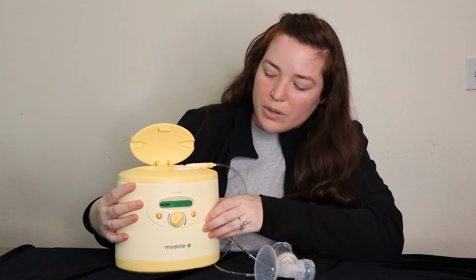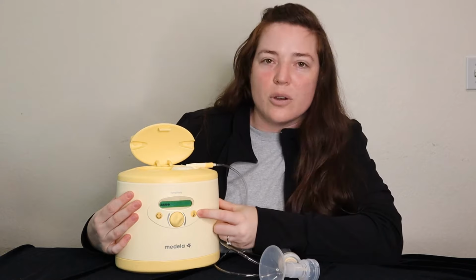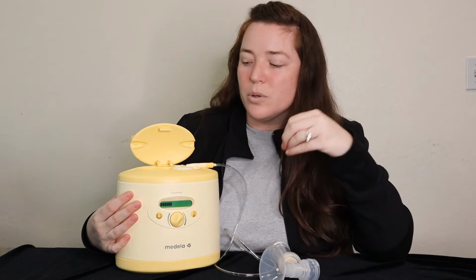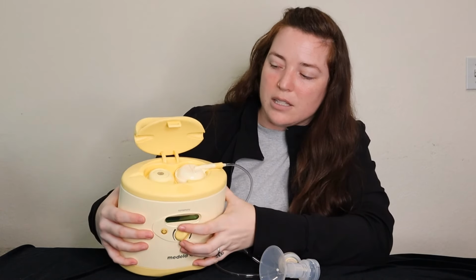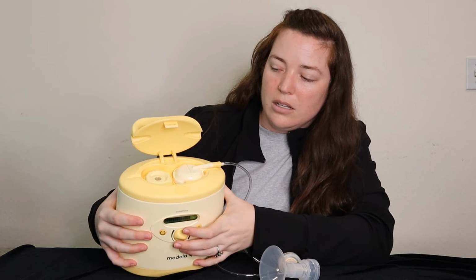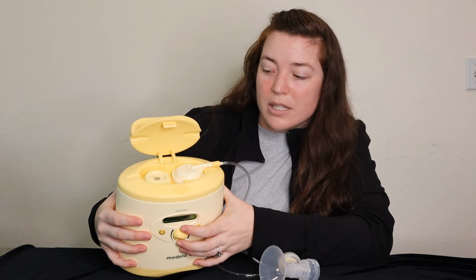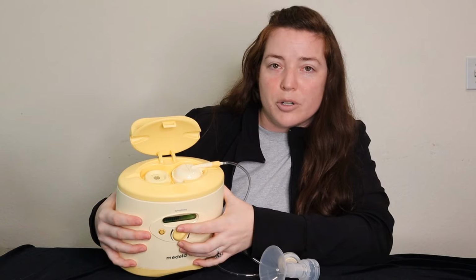Once your milk starts flowing, you're gonna wanna hit this button with the arrow and the drops, and that puts it into expression mode, which is those longer, deeper pulls to really get the milk out. So you can see it's moving a lot slower. And we want the suction to be strong but not uncomfortable. So mess with the dial until you find where it's comfortable for you.